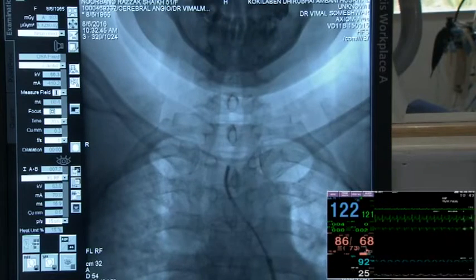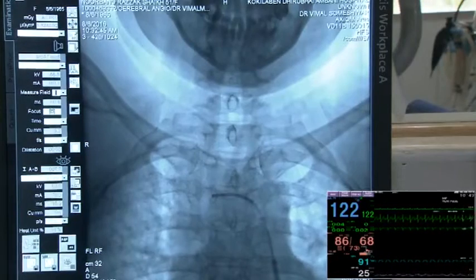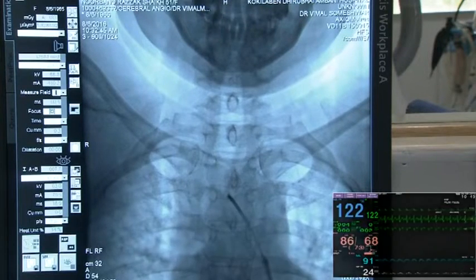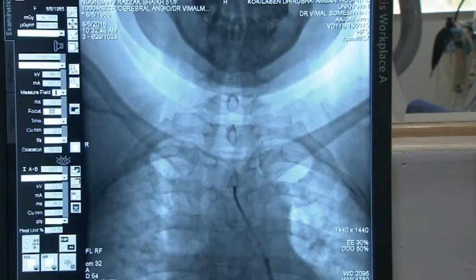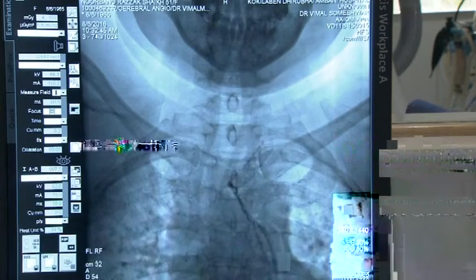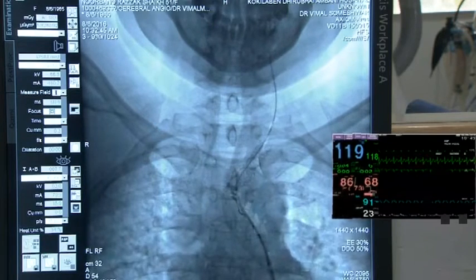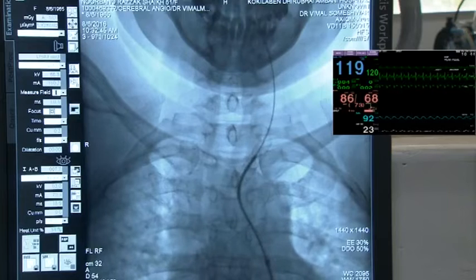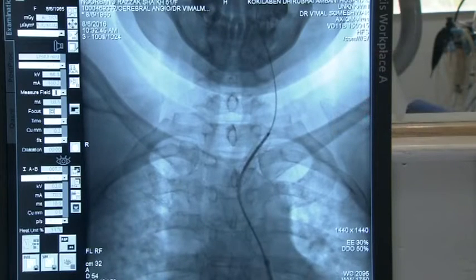And these are the number of patients, because numerous patients with severe AS are not getting treated because they are considered as a high risk for surgery. And that's where this field is evolving, having two different types of valve which have undergone the trials and approval in the United States, the Sapien and the CoreValve. One is the balloon expandable.